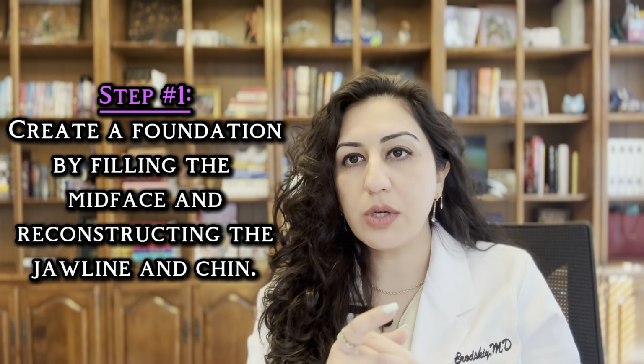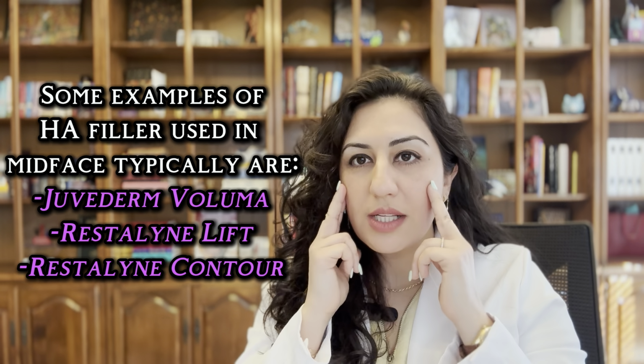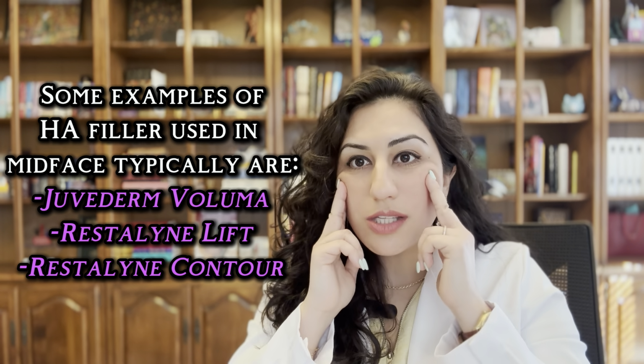So generally, we always start with looking at the mid-face and the jawline. Generally, these are the patients that have lost volume and start to have that sagging in that mid-cheek area. So you start with filler in the cheeks. This will allow for lifting of that lower half of the face. By doing this first, you're decreasing the amount of filler that you will need to use later on when you're assessing the nasolabial folds and the marionette lines.